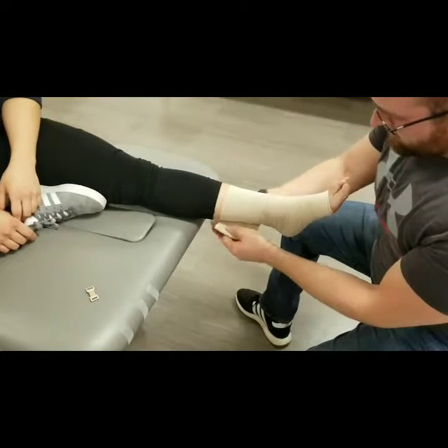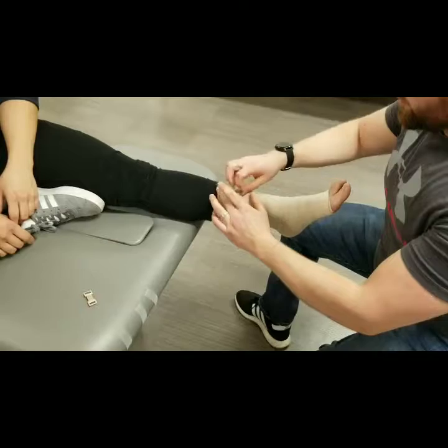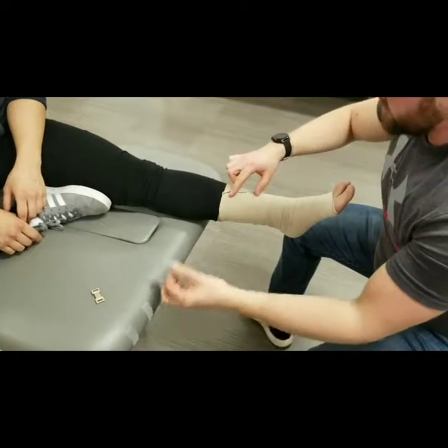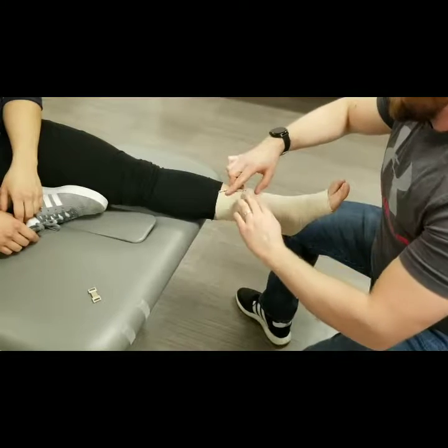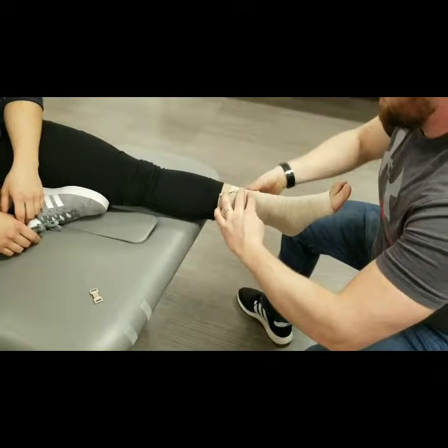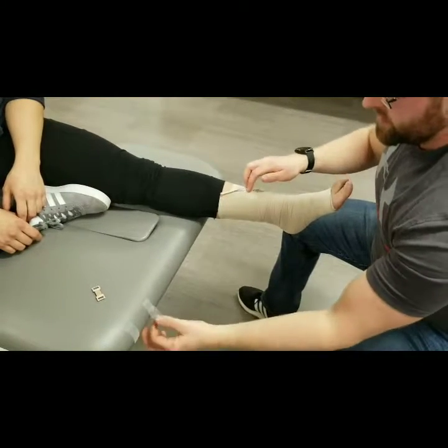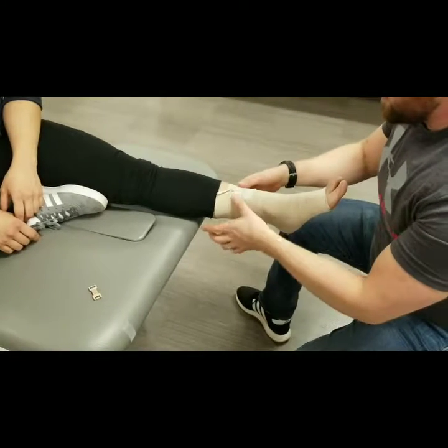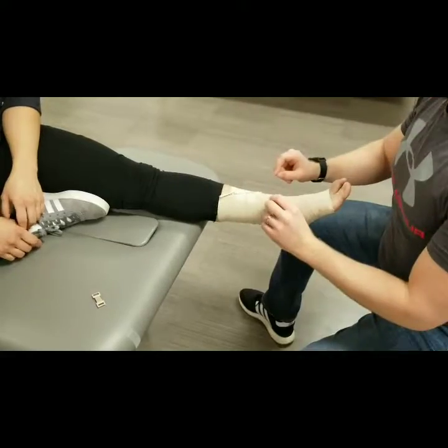We're up here at the end, again making sure there's no creases. Then we're going to take some tape. This would ideally be paper tape. We're going to tape this in place so that it does not move. And then we would slide the pants down over top.